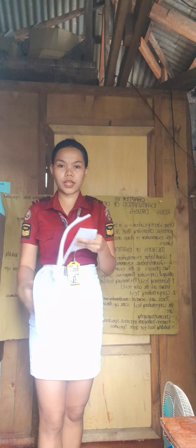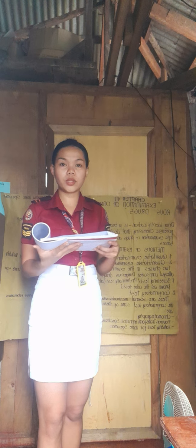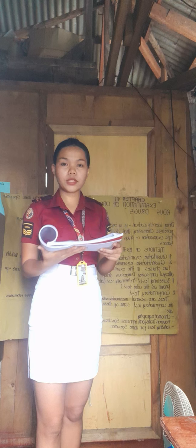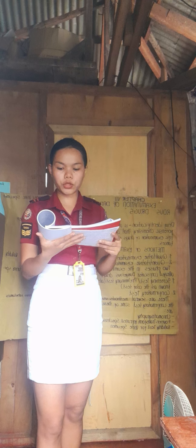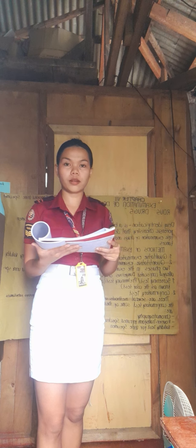Drug identification is usually conducted by a forensic chemist or chemical officer to determine the presence of dangerous drugs in submitted specimens. The forensic chemist or chemical officer also conducts drug tests on body fluids of suspected drug pushers and users to determine the presence of dangerous drug metabolites.